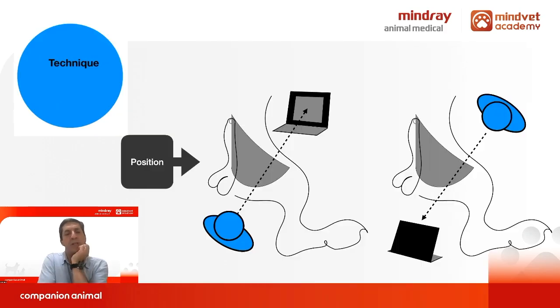One of the important things is the ergonomic setting of our technique. It's super important to be aligned along our visual axis with the ultrasound and all the setting we are going to use to perform the block.